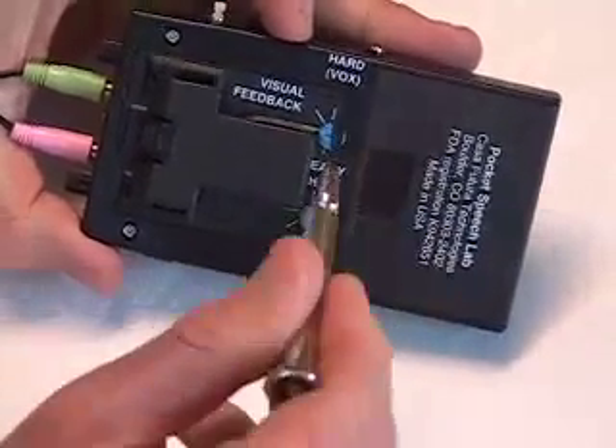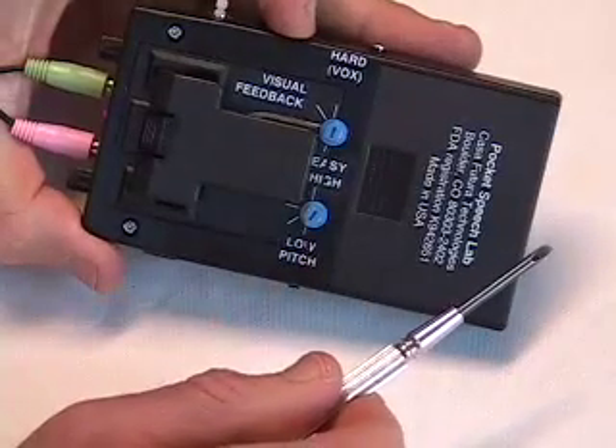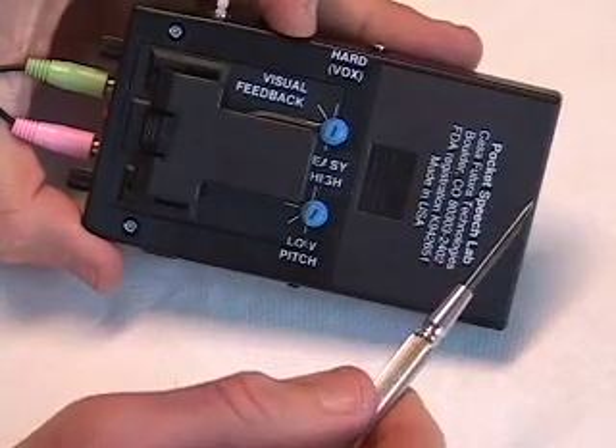If you adjust the control to hard, the light will instantly switch red when you talk and green when you stop talking. You'll use this when you want voice activation.